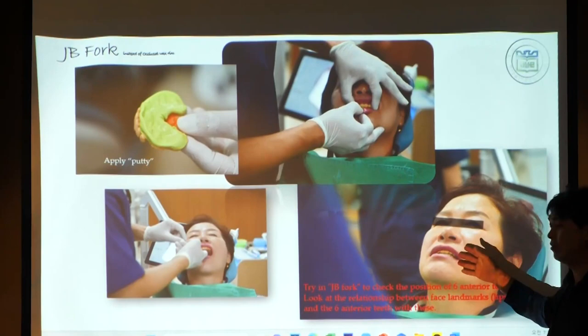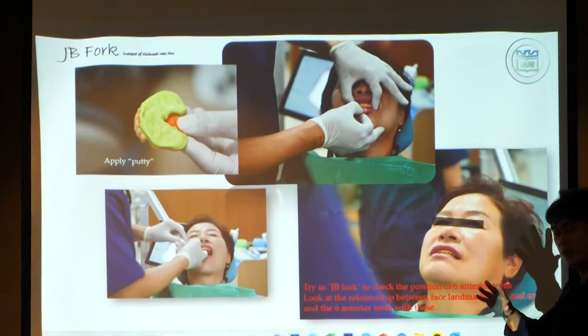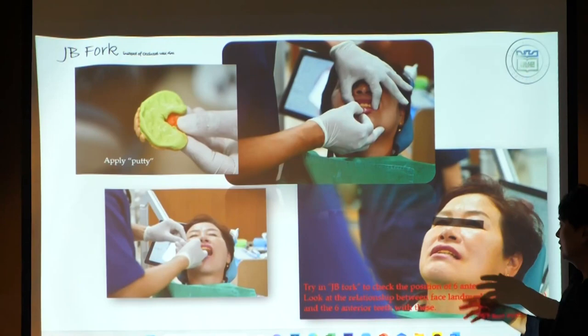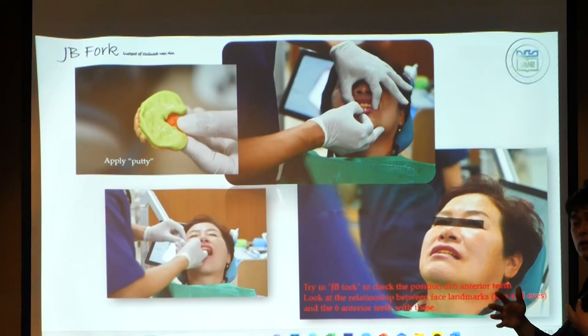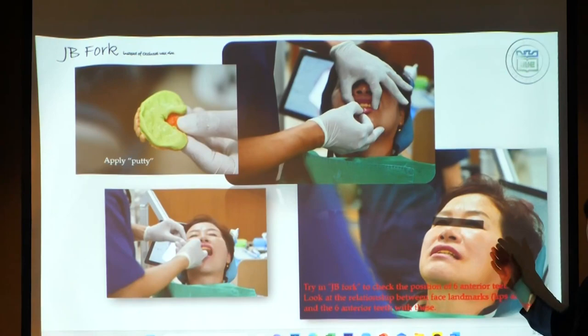Especially in the case of an elderly person, they always come with their daughter or their son, and I always call their present protector and discuss together, because elderly people cannot express their opinion properly. At that time I discuss with her son or daughters. Anyway, this confirmation step is essential to proceed with the JB fork. Okay?